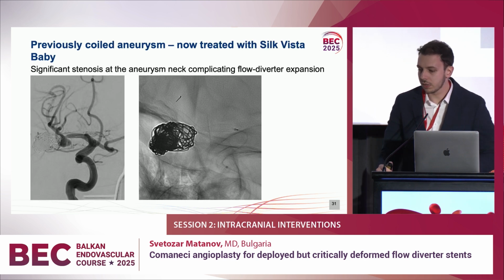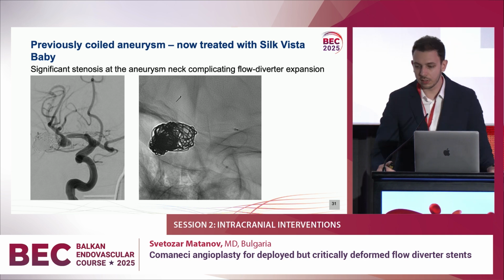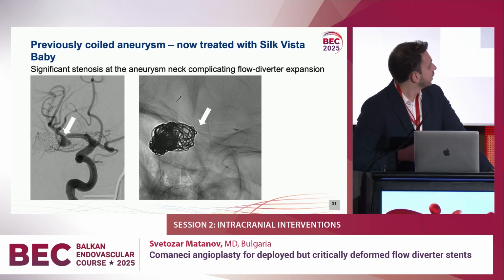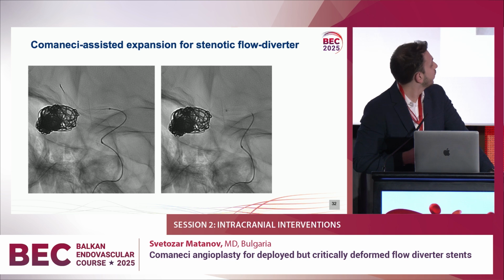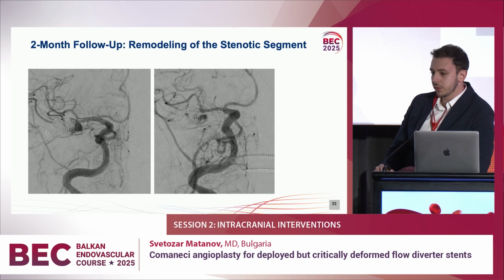And the case that Dr. Sirakov presented of this aneurysm with some intracranial stenosis at the level of the neck, this thing here. We already knew that the stent wasn't going to open properly. That's why we placed a Comaneci device. And as you can see at the follow-up, at 2 months, the vessel is absolutely remodeled.